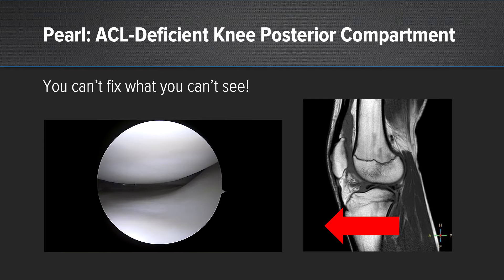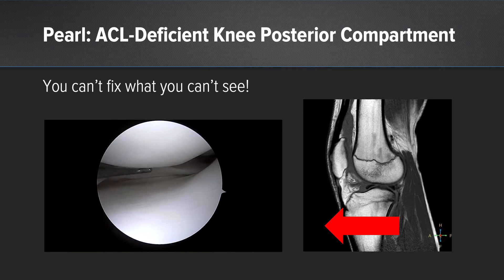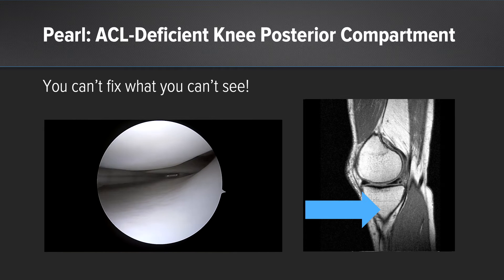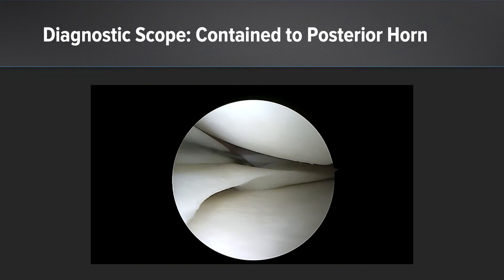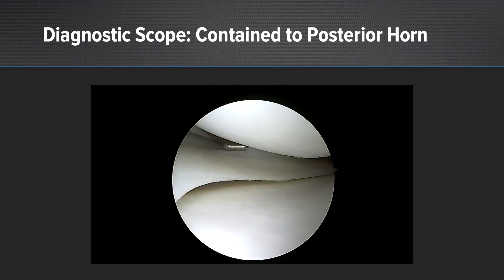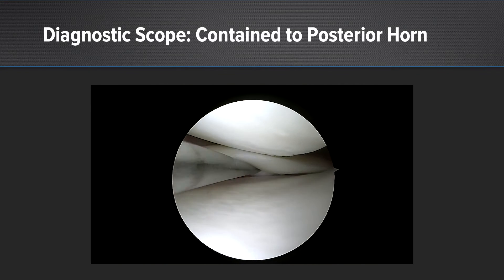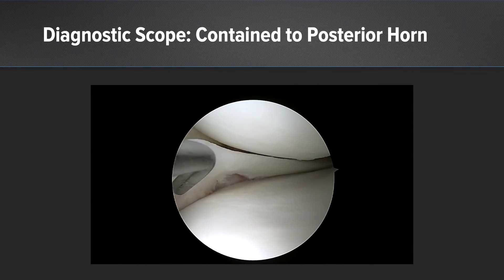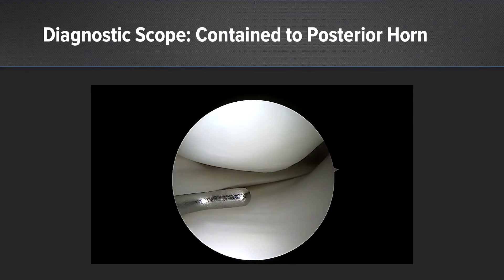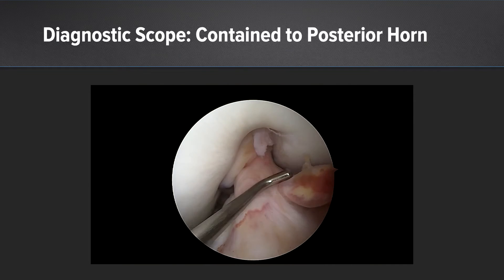With this ACL-deficient knee, my first pearl is: you can't fix what you can't see. When you initially get into this scope, the tibia is subluxed anteriorly because of the ACL deficiency. In order to see better, we need to apply a posterior drawer and then valgus, and you can see that really opens up our tear site. Now we get a complete diagnostic arthroscopy, and what you can see is that this tear perhaps progressed since the time of the MRI — remember your MRI is just a snapshot in time. The tear is contained to the posterior horn and does not extend much into the body.